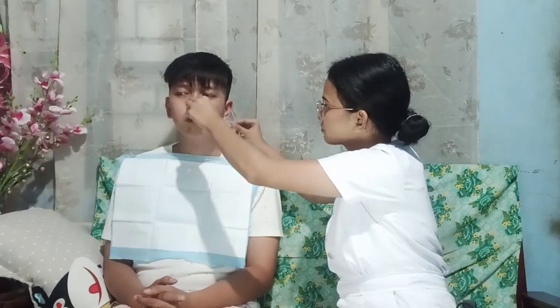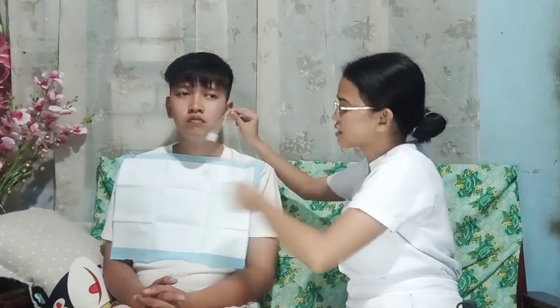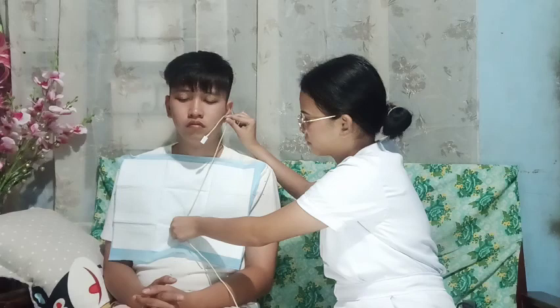For my adult patient, assuming that this is a tube, to determine the length, I will measure from the tip of the client's nose to the tip of the client's ears, and then to the xiphoid process. After that, I will put micropore tape on the tube for me to know the proper length.